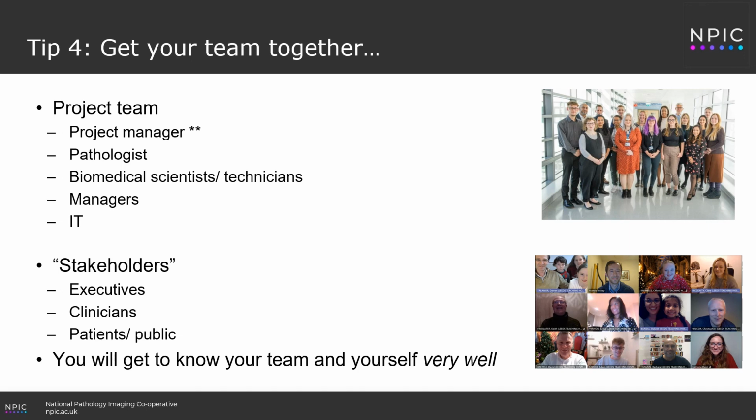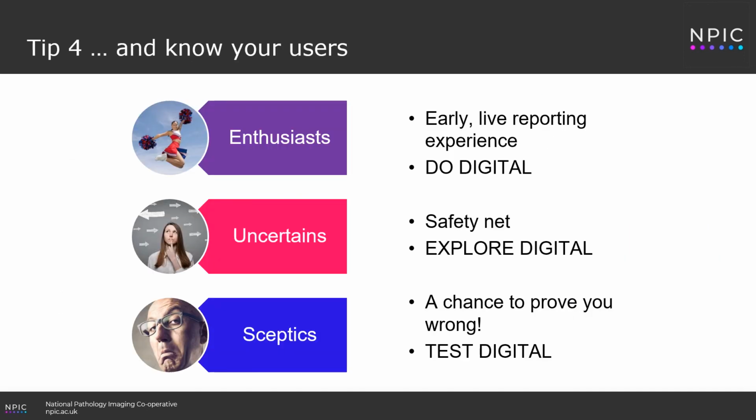And you are going to get to know your team and yourself very well through your digital pathology deployment, so choose them carefully. And of course, you must know the most important stakeholders in your project, your users, your pathology colleagues who are going to be using these scanners and these images to do their jobs. And Bethany Williams has designed this characterization of your users, which we found to be remarkably consistent across digital pathology deployments worldwide.